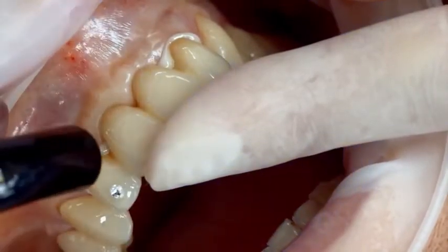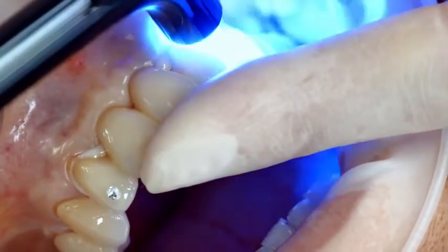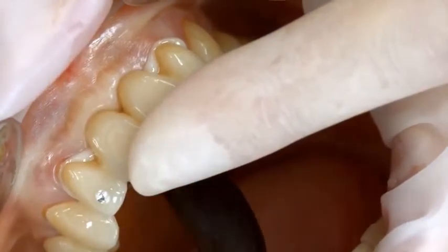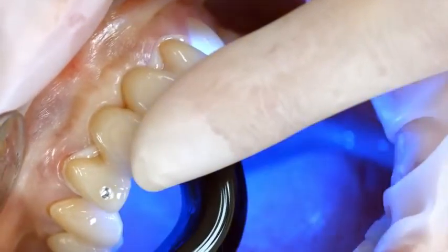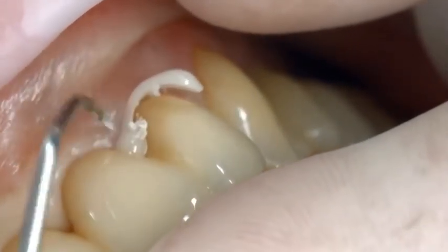Light cure excess cement with a polymerization light, such as Blue Phase N, at a light intensity of 650 milliwatts per square centimeter, for one to two seconds per quarter surface. Make sure that the distance between the light probe and the restoration is 10 millimeters at maximum.